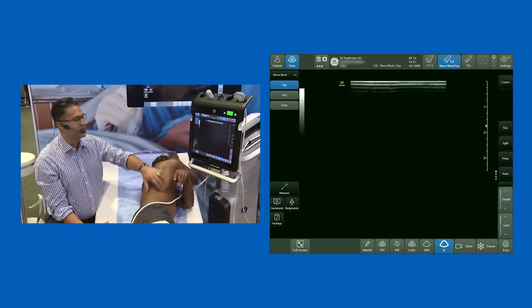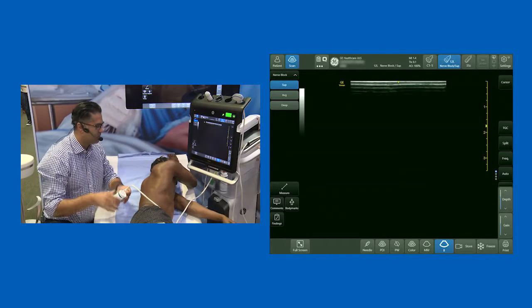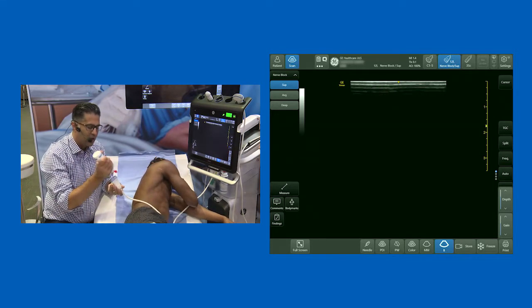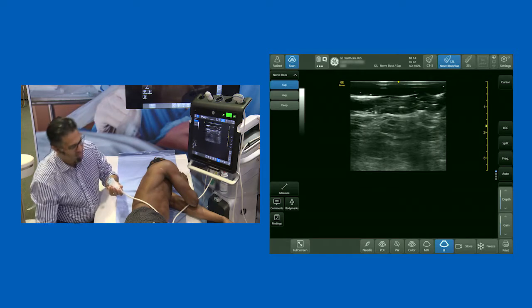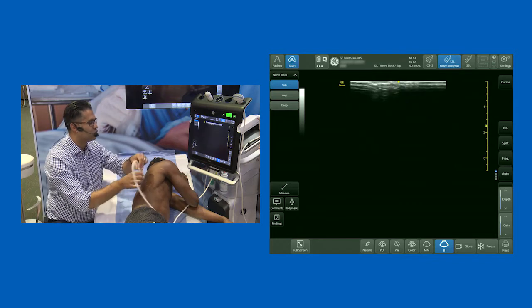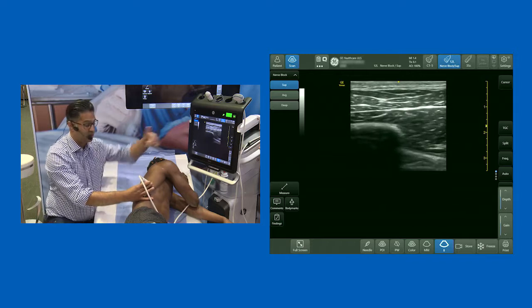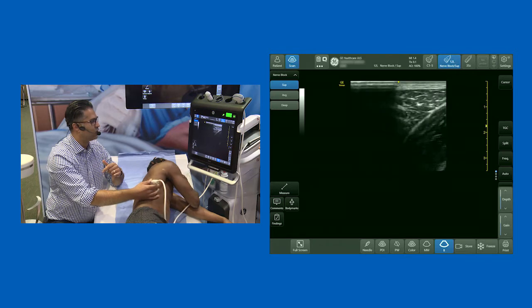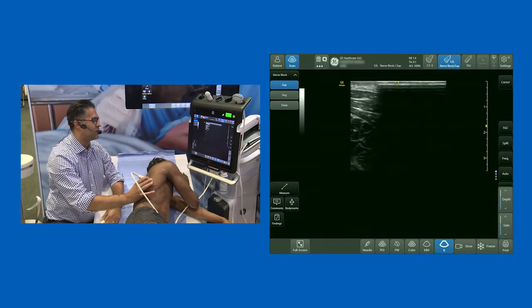There's a big muscle over here called the latissimus dorsi. There are normally a few tricks we employ to identify that. I've intentionally got the patient positioned on the side because the serratus plane block is probably easiest performed in this position. A lot of Australian colleagues who work in trauma centers prefer the patient supine, but generally I find this easier. I'm going to have the left-hand side of the screen as posterior and the right-hand side as anterior.